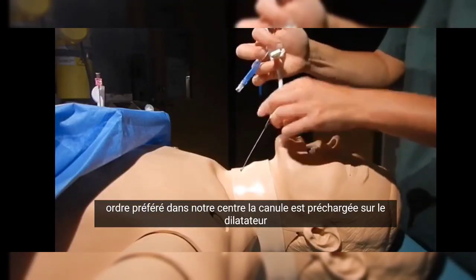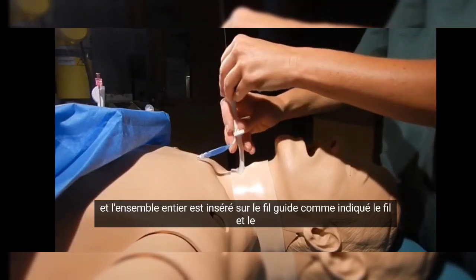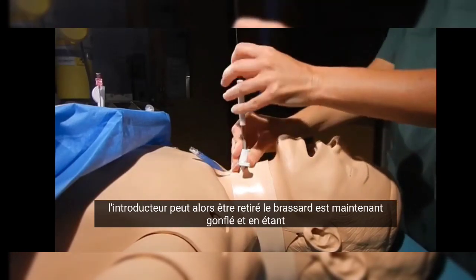The cannula is preloaded over a dilator, and the whole assembly is inserted over the guide wire as shown. The wire and the introducer can then be removed.